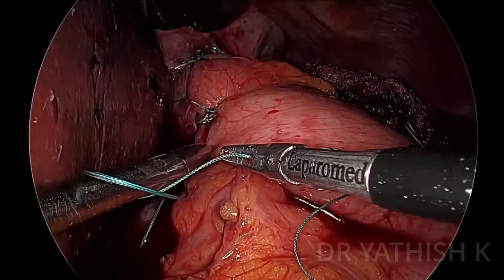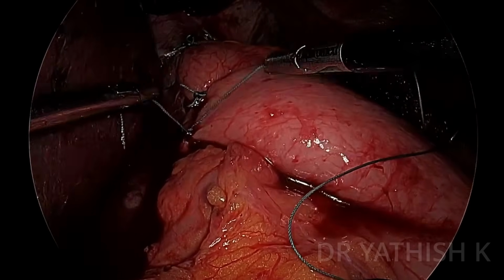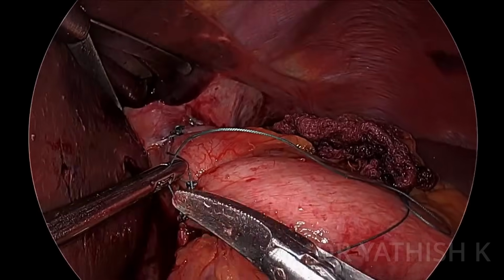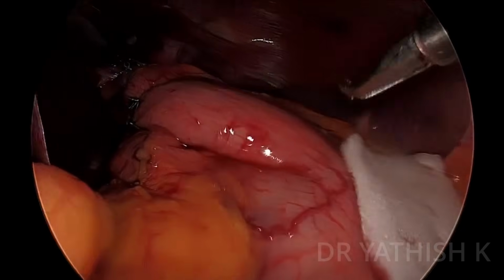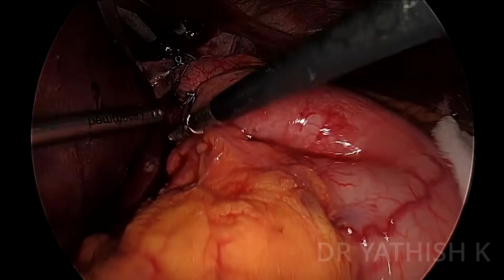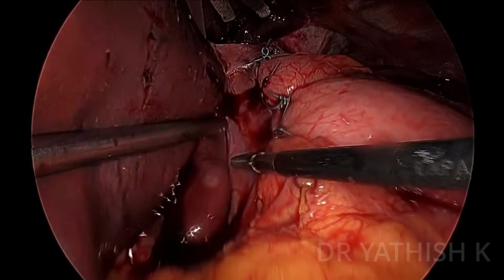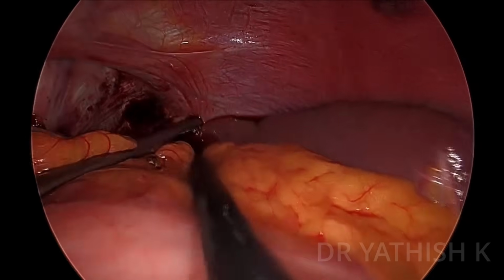So to summarize, first, obtain a good exposure before starting the myotomy. Second, identify the GE junction. Third, preserve your anterior vagus nerve. Fourth, divide the muscles completely while staying close to the submucosal plane. Fifth, ensure adequate extension both proximally and distally. And sixth, check for the mucosal integrity. And finally, your loose wrap creation.